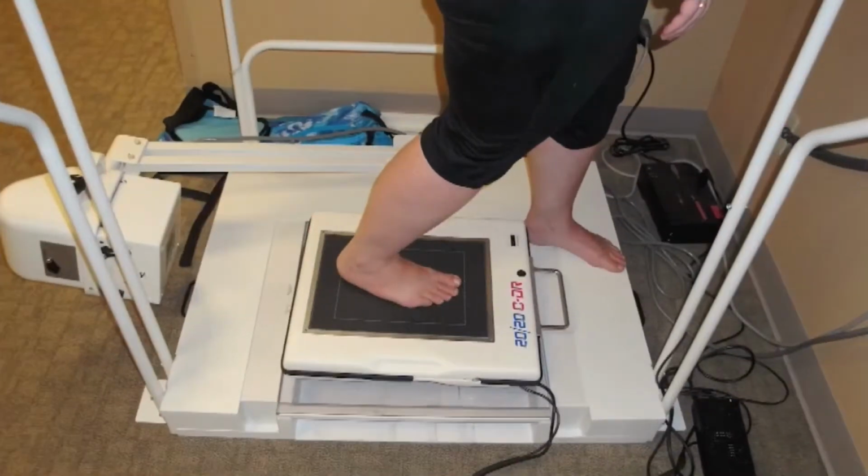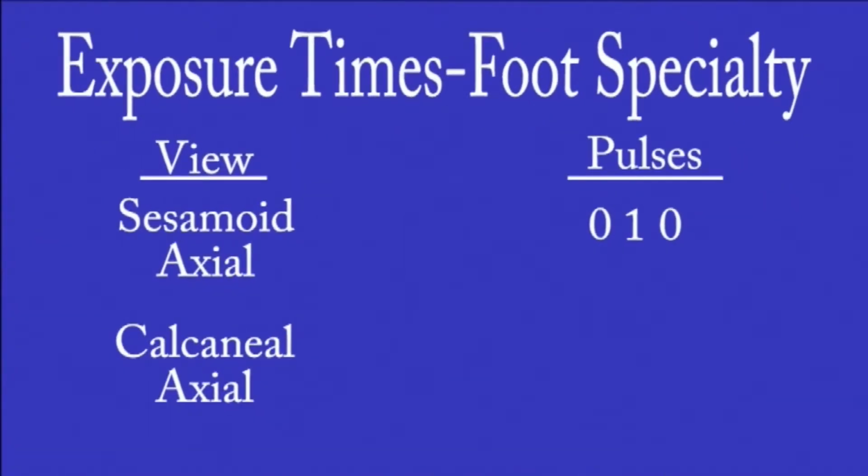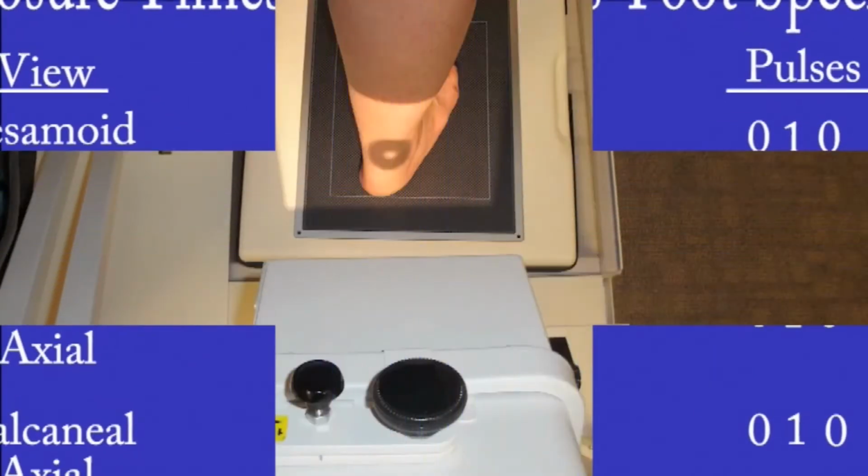Have the patient place their foot in the middle of the cassette and bend their knee forward while keeping their heel flat on the cassette. This allows the joint to be open and a better visual of the ankle and calcaneus to be seen. The pulses will be set much like the sesamoid axial at 0, 1, 0. Now take the X-ray.